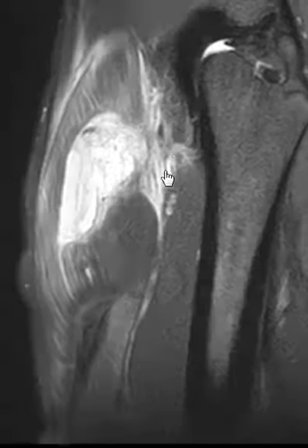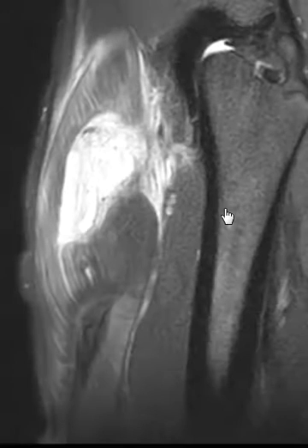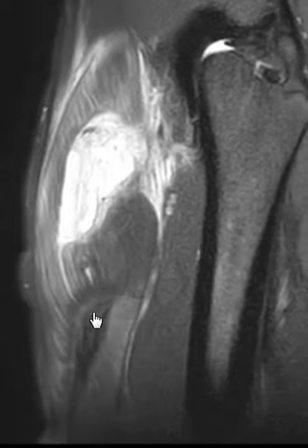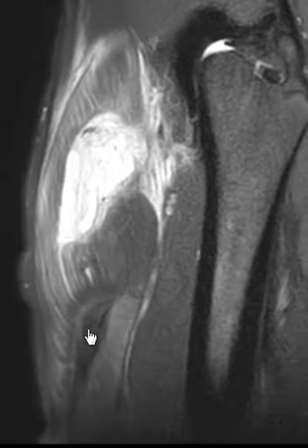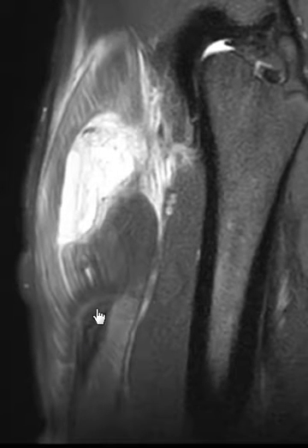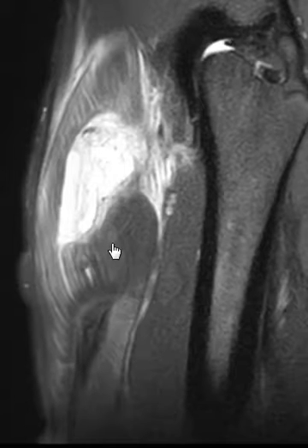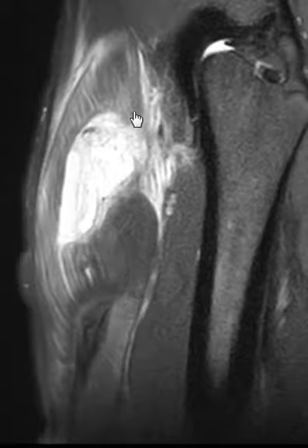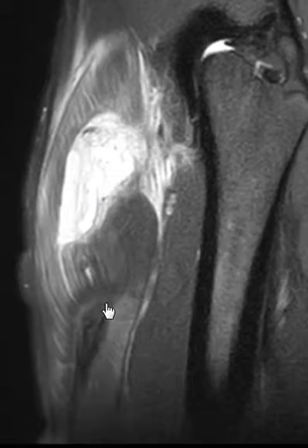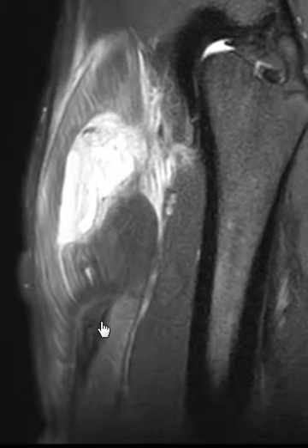This is a sagittal view. Here's the front of the thigh, here's the femur, and you can see the muscle fibers that are retracted down. There's a black thing here — this is the central tendon. This is the indirect head of the rectus femoris muscle. There's a direct head in the periphery, and then the more central portion has a central tendon that connects to muscle — that is the indirect head.